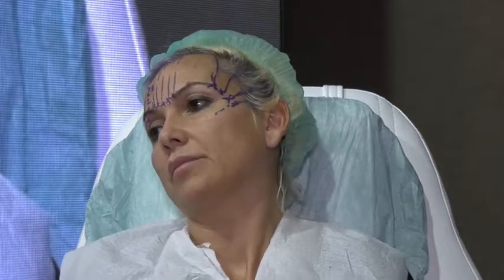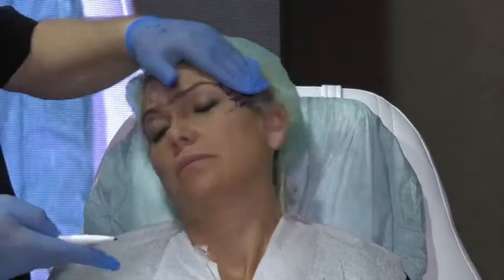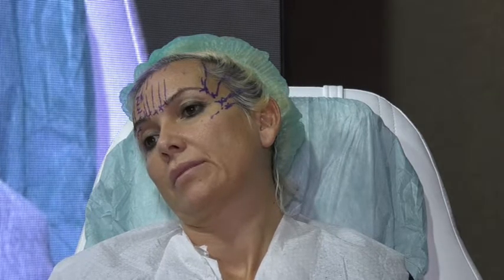The second zone is the easiest zone. Look, the mid face. When we lift the mid face, we go towards where? The temporal zone. Why? Because this is the normal anatomy. This is the lifting, this is the weight. Normally, as a standard I need an average of 3 threads per zone.